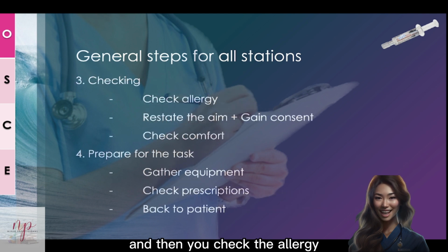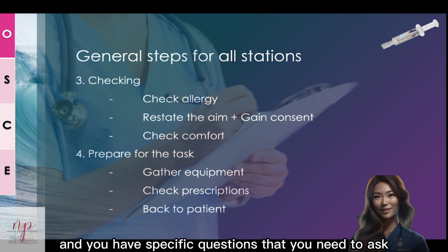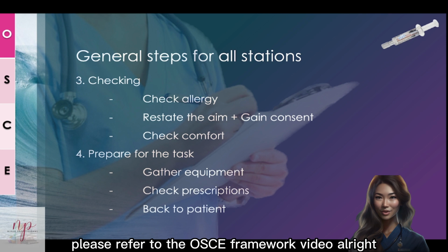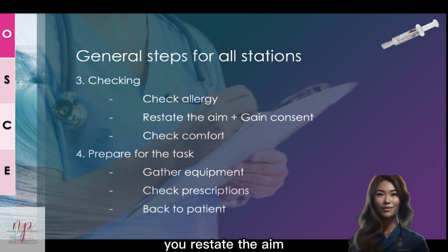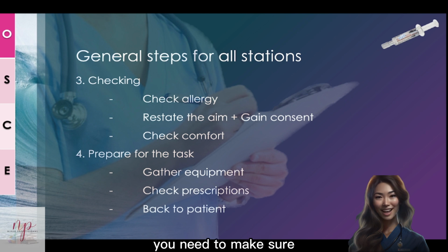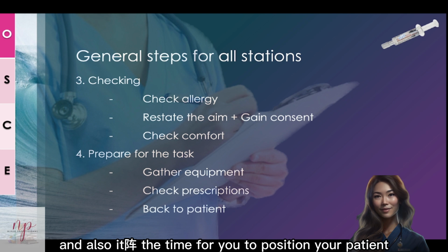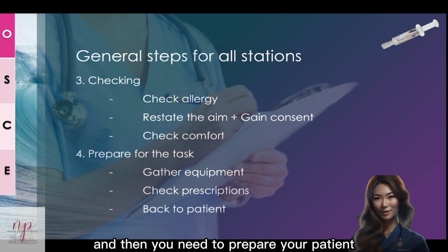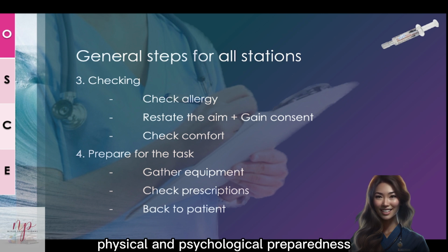Then you check the allergy, and there are specific questions that you need to ask. Please refer to the OSCE framework video. And then you restate the aim. This time you need to give more details to your patient, and you also need to gain consent to proceed. Then you need to check comfort. You need to make sure that your patient is comfortable, and it's also the time for you to position your patients if the task requires it. And then you need to prepare your patients, physically and psychologically.